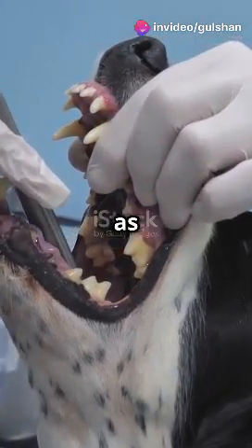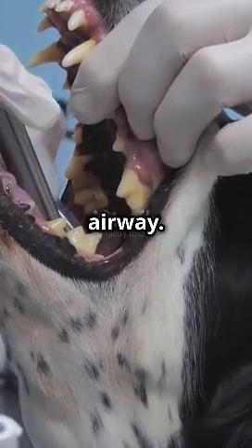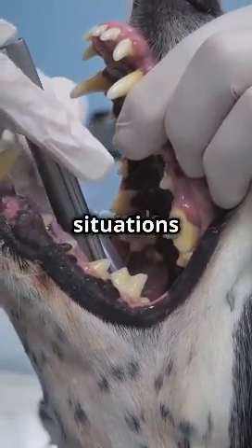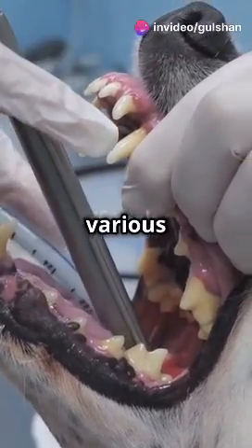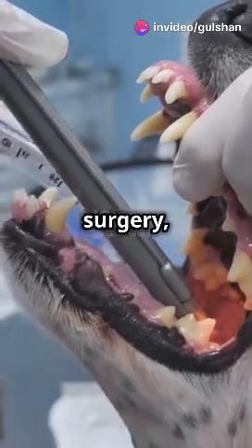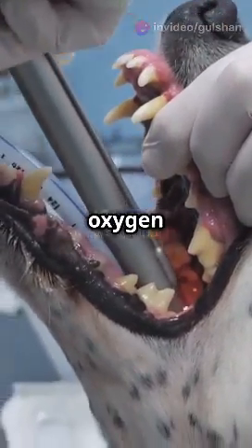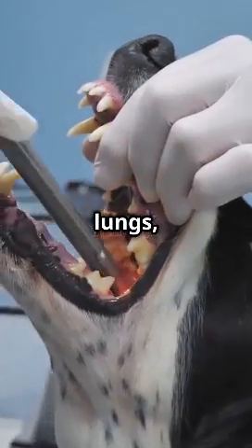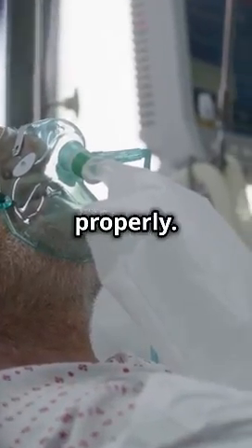Intubation, also known as endotracheal intubation, is all about securing a patient's airway. This procedure is essential in situations where a patient is unable to breathe on their own due to various reasons such as trauma, surgery, or severe illness. By securing the airway, we ensure that oxygen can be delivered efficiently to the lungs, which is vital for the patient's survival, to ensure they can breathe properly.